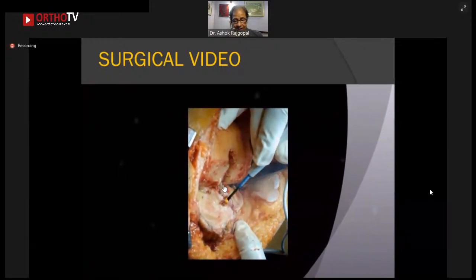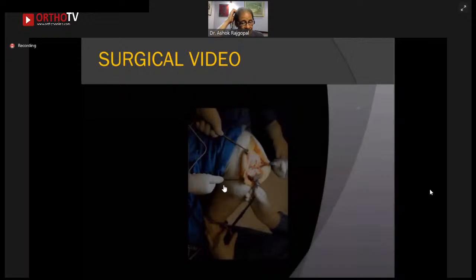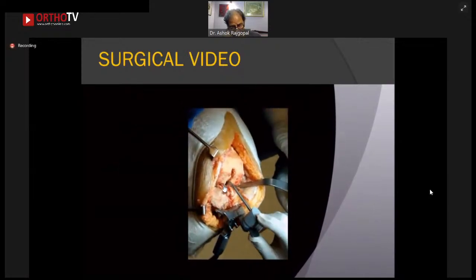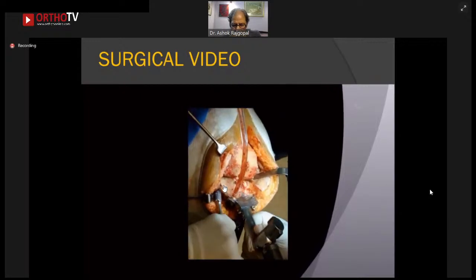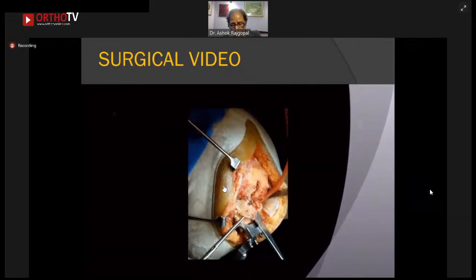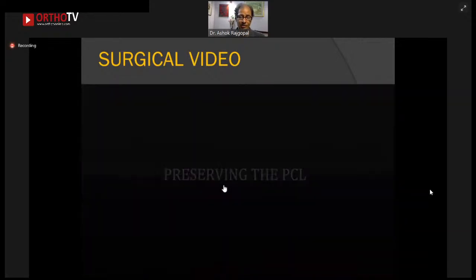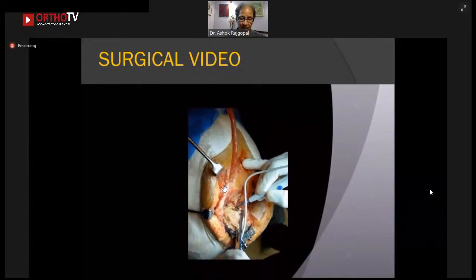You may have noticed that we do not use Hohmann retractors. And so again, we are marking out the Akagi line. We take the tibial resection using an extramedullary system. Again, 5-6 millimeters, 7 at the most. In fact, we use a slightly bigger tibial wafer if there is less deformity. If it's like 5 or 10 degrees, we typically take about 8 or 9 millimeters of the tibia. If it is very severe deformity, we'll cut down on our tibia and go down to about 5-6, almost always under 7 millimeters. So once you've done that, you take down that tibial wafer, and you try to preserve the PCL by cutting around the posterior notch of the resected tibial segment.